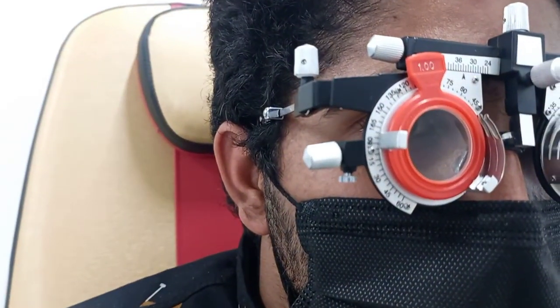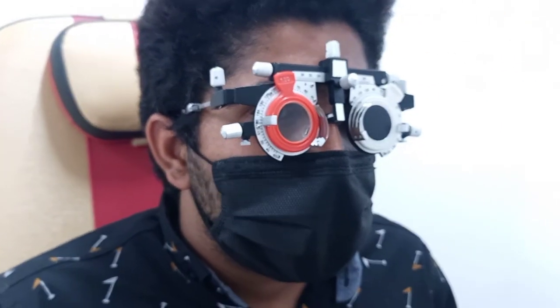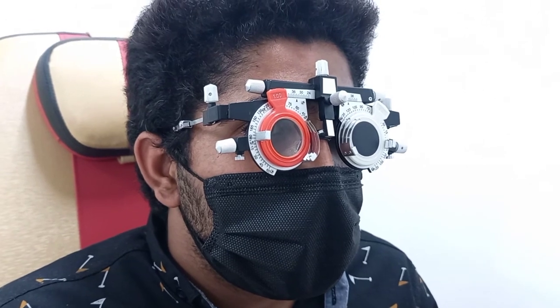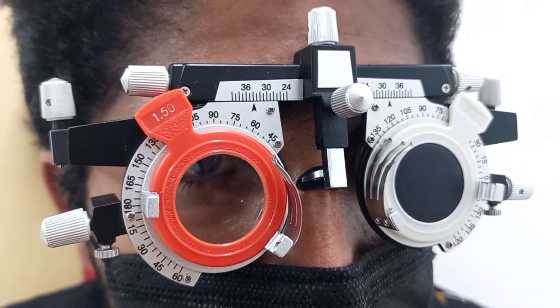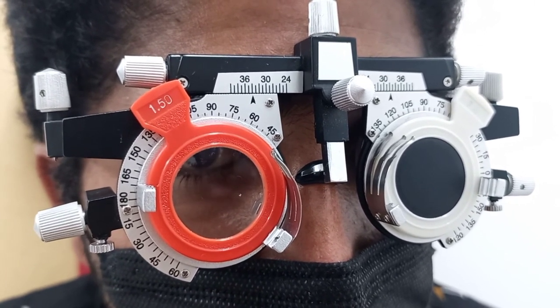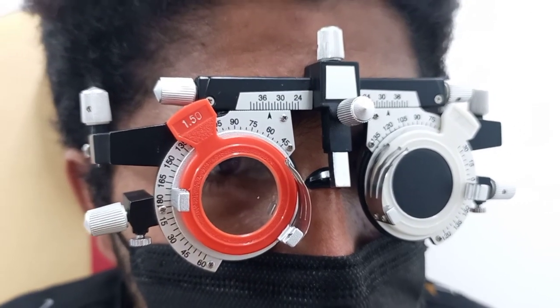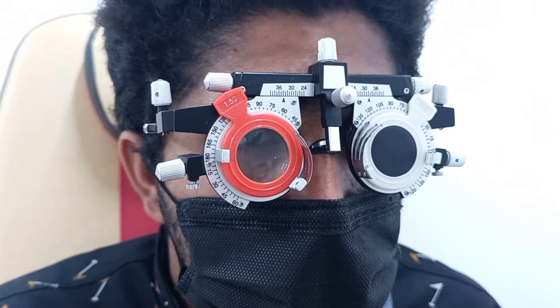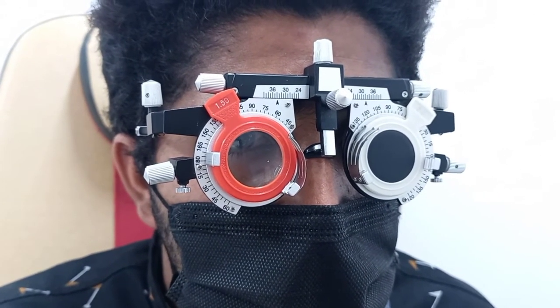The last probe lens was minus 0.50 spherical. I increase the minus power to minus 1.00 spherical — the patient confirms the visual acuity is improving. I increase further to minus 1.50 spherical and the patient's visual acuity continues to get clearer. I will keep increasing the minus power until the patient reaches maximum visual acuity.